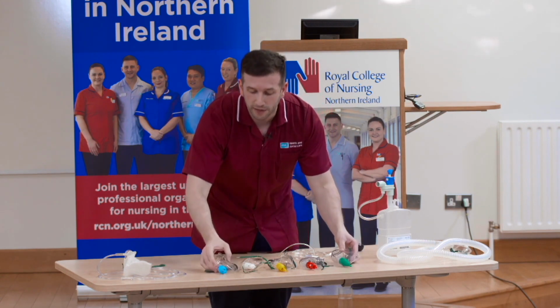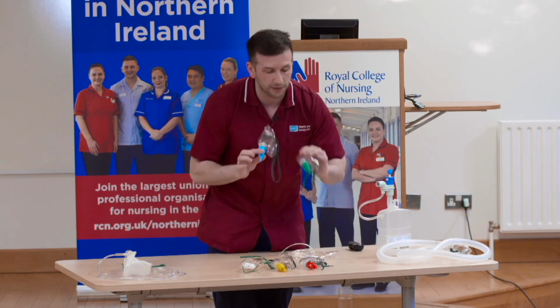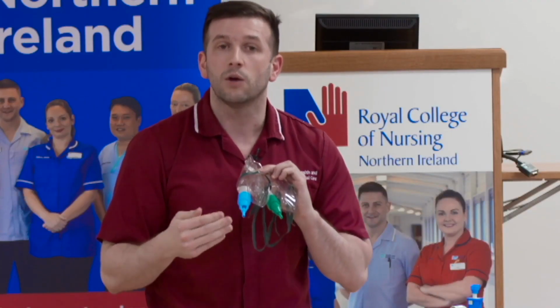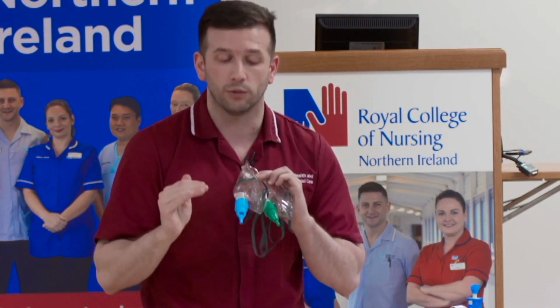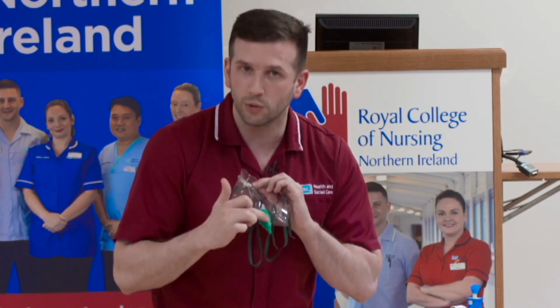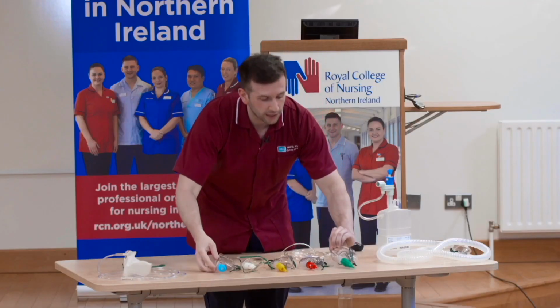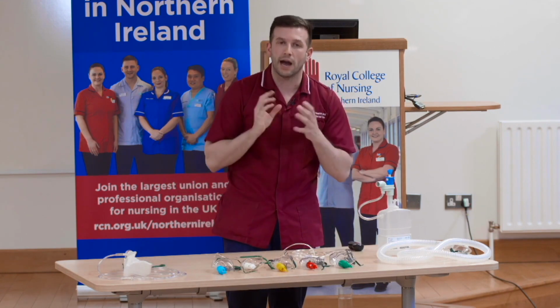How these work all depends on the size of these vents, and perhaps these are the best two to show the difference between the two. The larger the vents, the more room air that can be entrained, which of course will dilute your oxygen concentration to give a lower FiO2. This one, which is 60% oxygen, has a more narrowed vent to allow the reduction of room air entrainment to give a higher FiO2. The important thing to remember about these is that they're used for acute oxygen therapy, and it's for accurate and controlled oxygen concentrations.